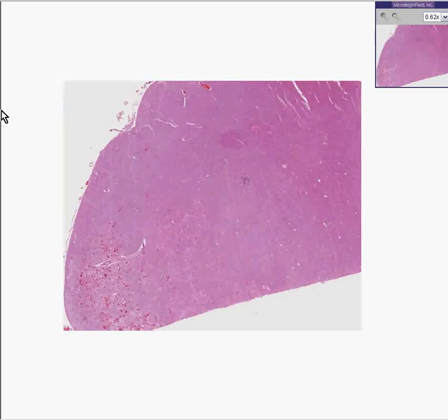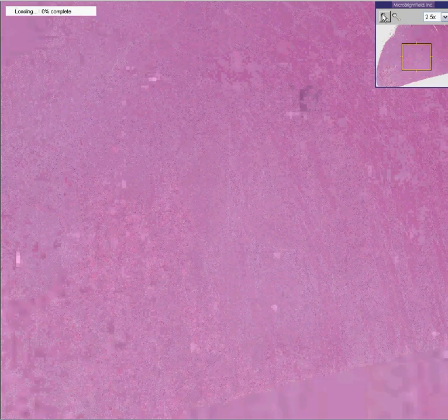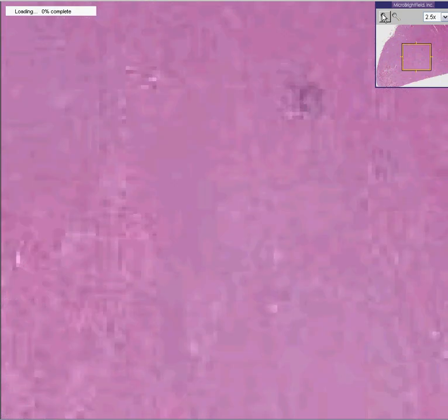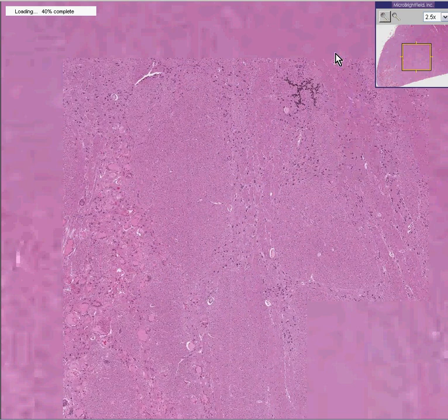If you are instantly thinking that this is some type of a brain or central nervous system tissue, you're right, because it is. And as soon as we focus, even the computer will agree with you. If we don't focus pretty quickly, we start all over and waste about a minute or two of our time. Sure, this is central nervous system.